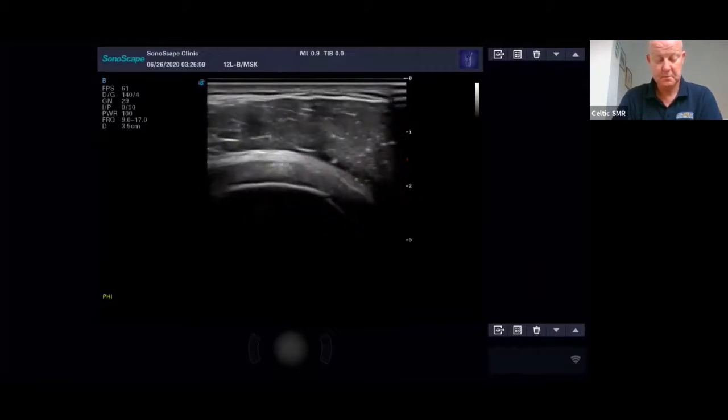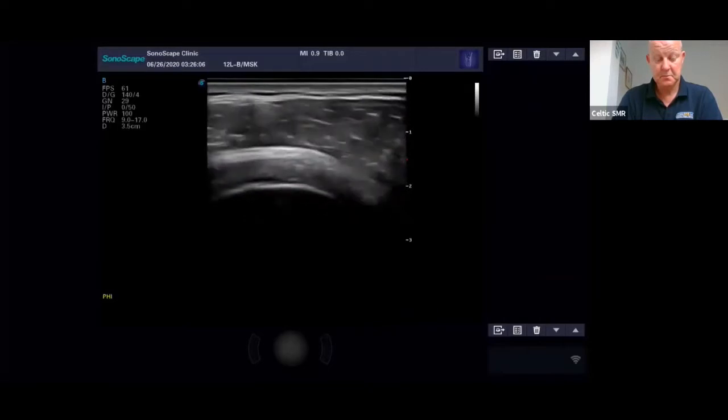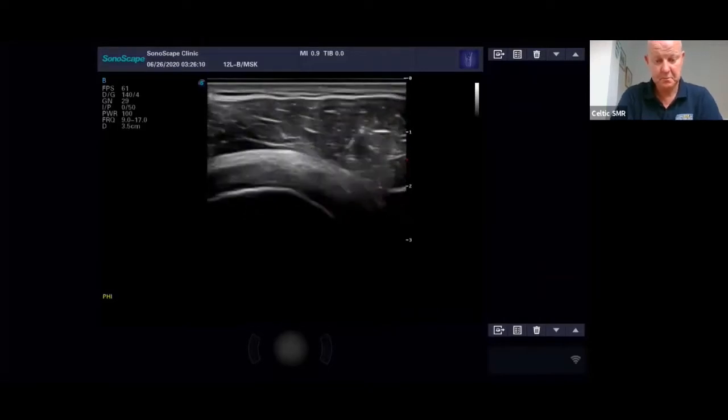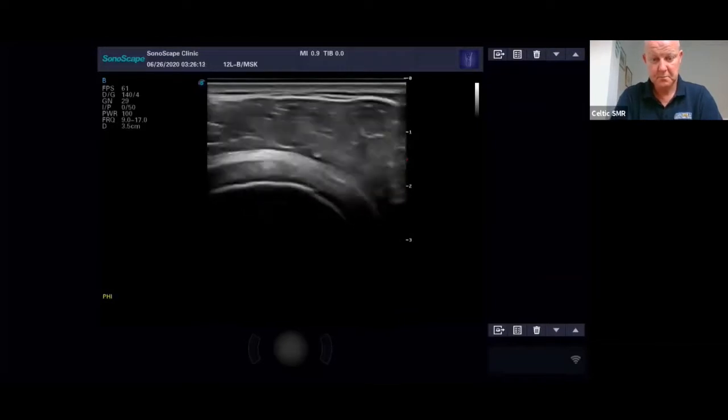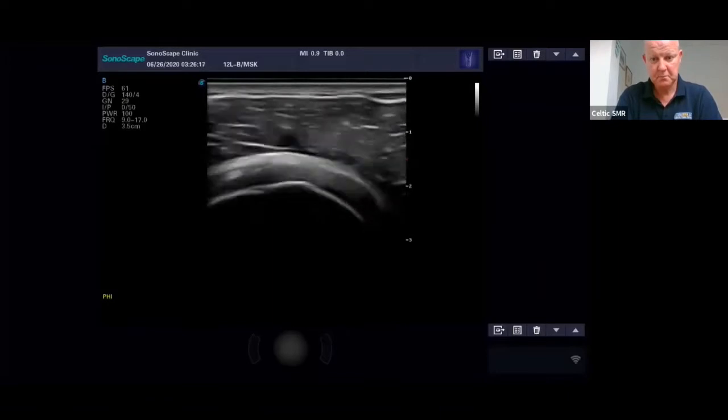You can get things like calcification within the tendon, and that will appear as basically a white blob. It may have some shadowing behind it, it may not, depending on what stage it's at, and those can be quite symptomatic as well.